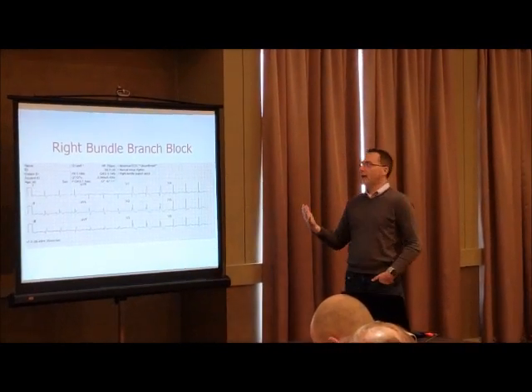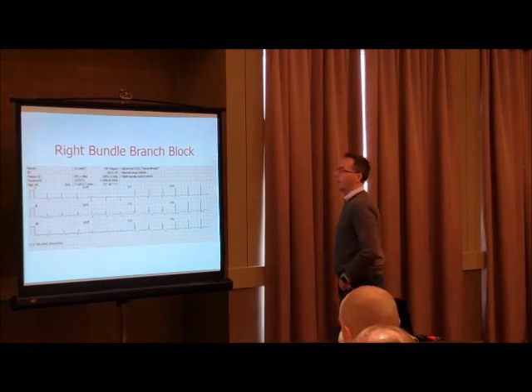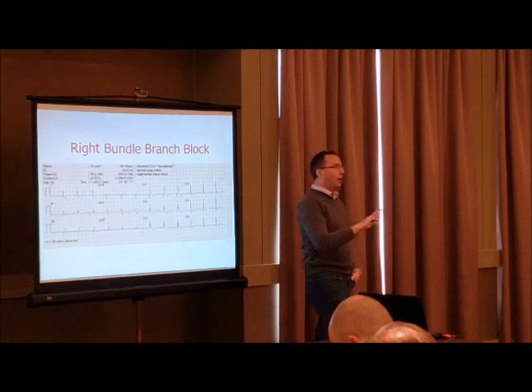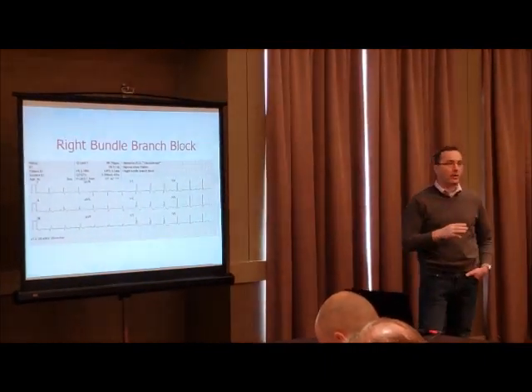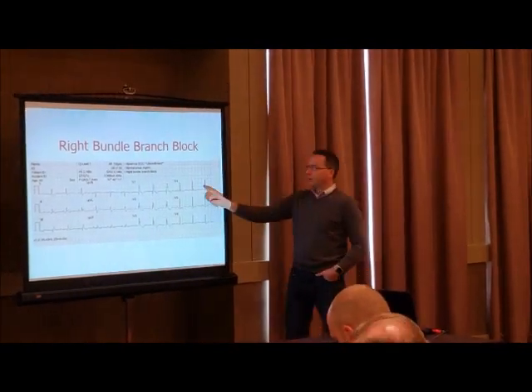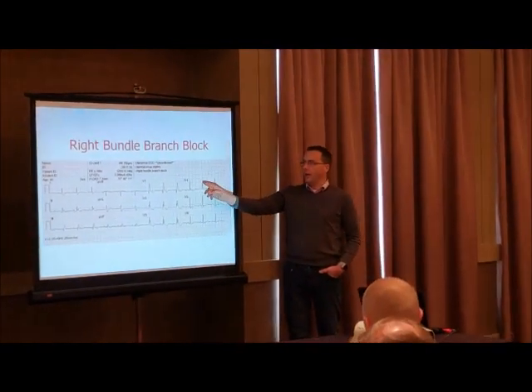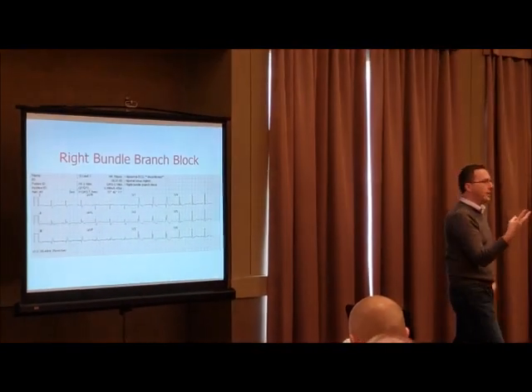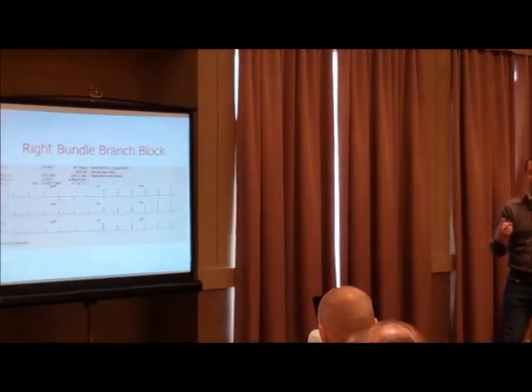So in this particular case, we always start with rate and rhythm. Right here, the rate is 75. Since that is one of the rates that falls into the large block method, gee, I wonder if there's 4 large blocks in between our waves here. And yes, you can see 1, 2, 3, 4, exactly 4 large blocks between our waves that we can confirm with our own eyes that yes, indeed, the heart rate is 75 here.